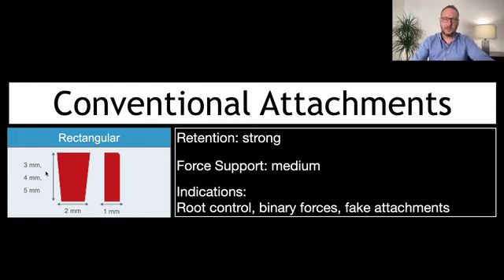One thing that we are going to learn when we start treating patients with aligners is that there is not only one right way to do attachments, okay? I can see a lot of different doctors using different kinds of attachments, and others not using attachments at all, depending on the way they plan the software. It's possible, and we can have good results.